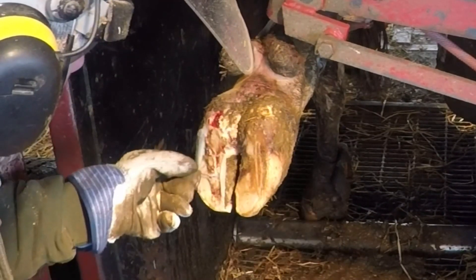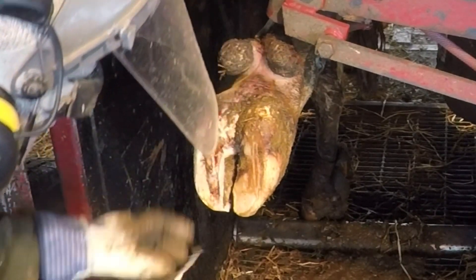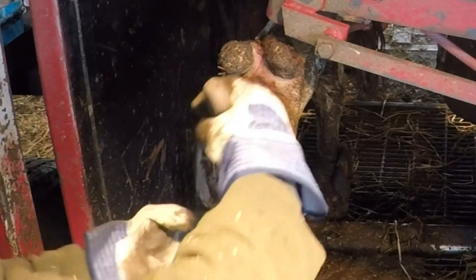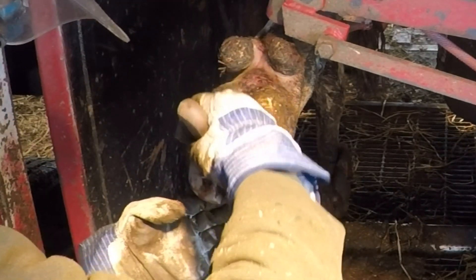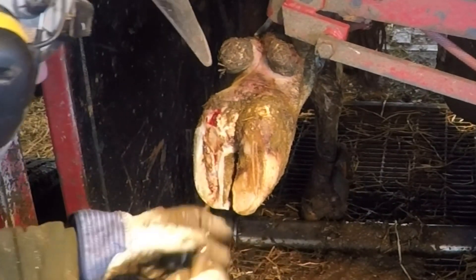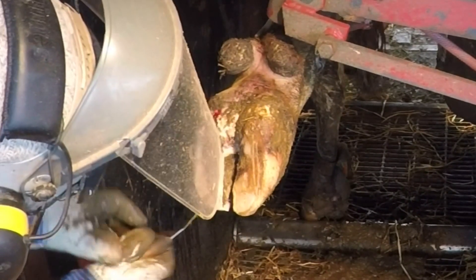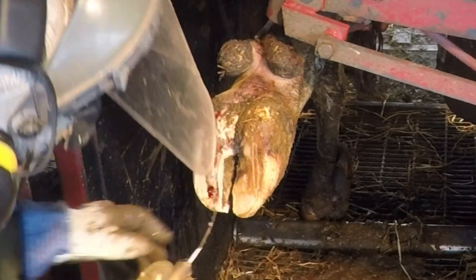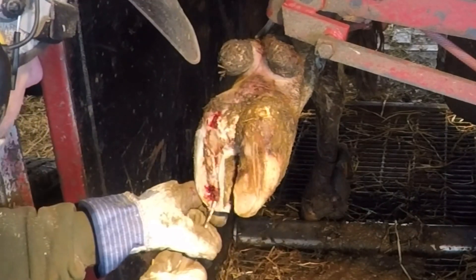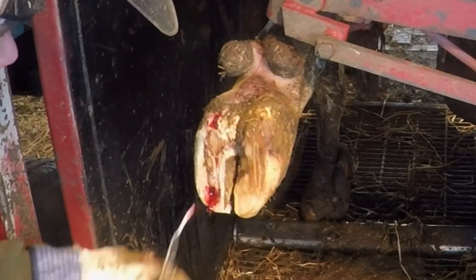One of the most important steps here to promote proper healing is to remove all this loose horn around the lesion itself. Any little piece that is still there that can irritate that open wound — whether it be an ulcer or a white line issue — can cause that lesion not to heal. So the key is to get all that loose hoof away so there's no pinching, no poking, or anything that can cause that ulcer to stay open.